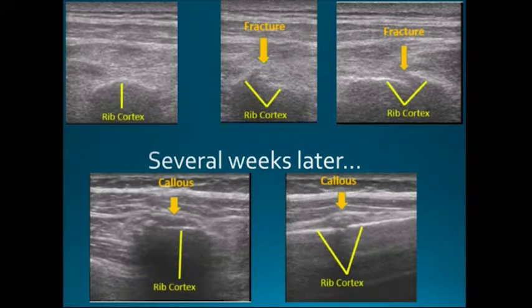And there's so many conditions that are kind of like that. When we can actually explain to our patients why they're having their symptoms and show them, he could understand this. He's an educated guy, but he's not a physician or anything, and he could easily look at those images just as you can and say, yeah, there's a problem there.